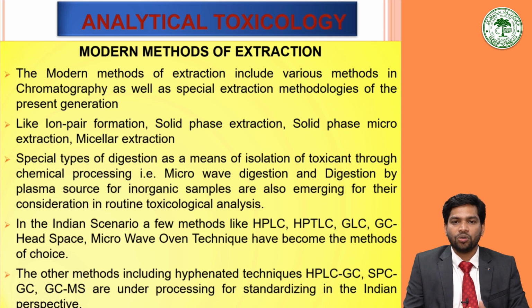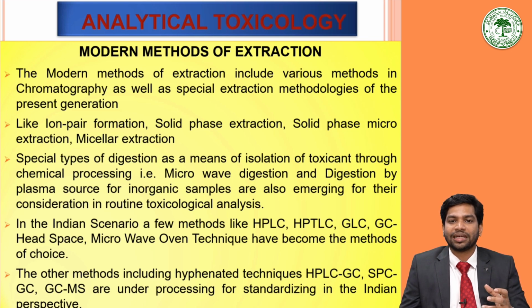Then certain modern techniques have evolved over time to speed up the process of the extraction. The methods include various methods in chromatography as well as special extraction methodologies like the ion pair formation, solid phase extraction, solid phase micro extraction, micellar formation. Then the special type of digestion as a means of isolation of toxicants through the chemical processing like microwave digestion, digestion by the plasma source for the inorganic samples, are also emerging for their consideration in the routine toxicological analysis.